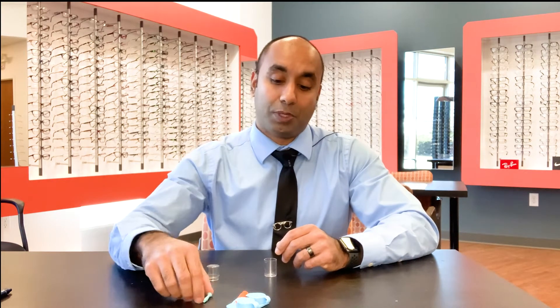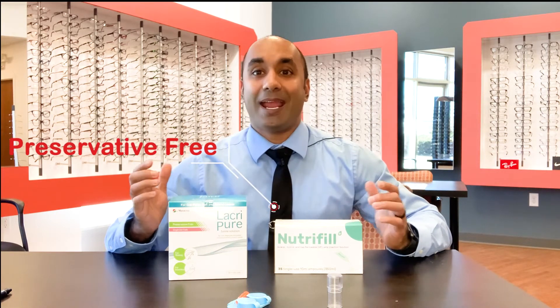To put the scleral lens on your eye, you're going to need a filling solution. There are two that we recommend: one is Nutrifill, and the other is Lacripure. The key to these filling solutions is that they're preservative-free. Any preservative will be very bad for your eyes, because once you fill the scleral lens and put it on your eye, there's no tear exchange — so this solution will sit on your eye all day. If it has preservatives, it can be toxic to the eye and cause damage to your cornea.